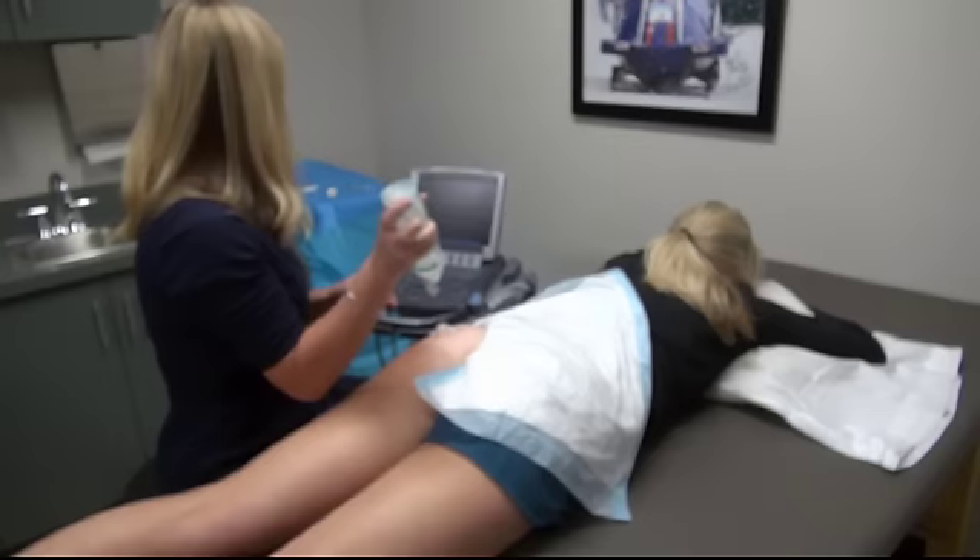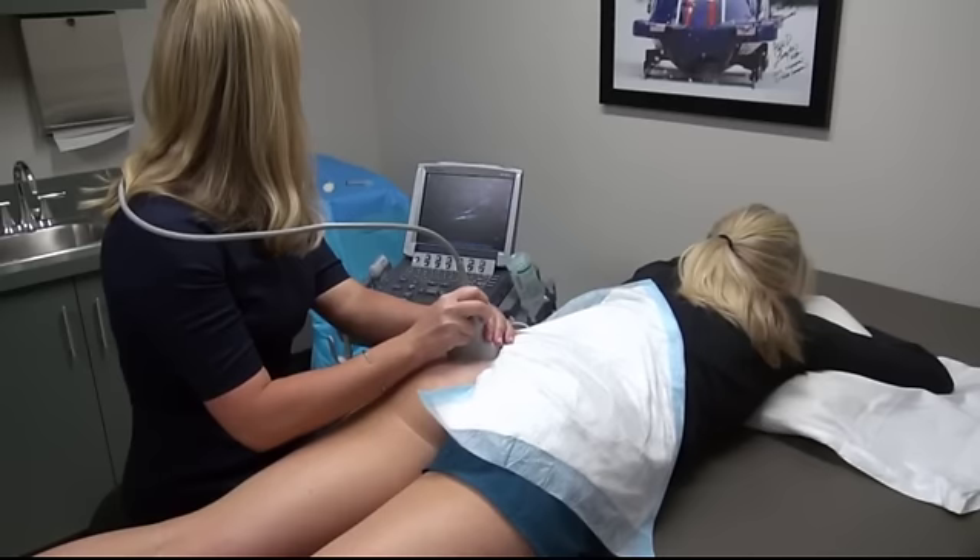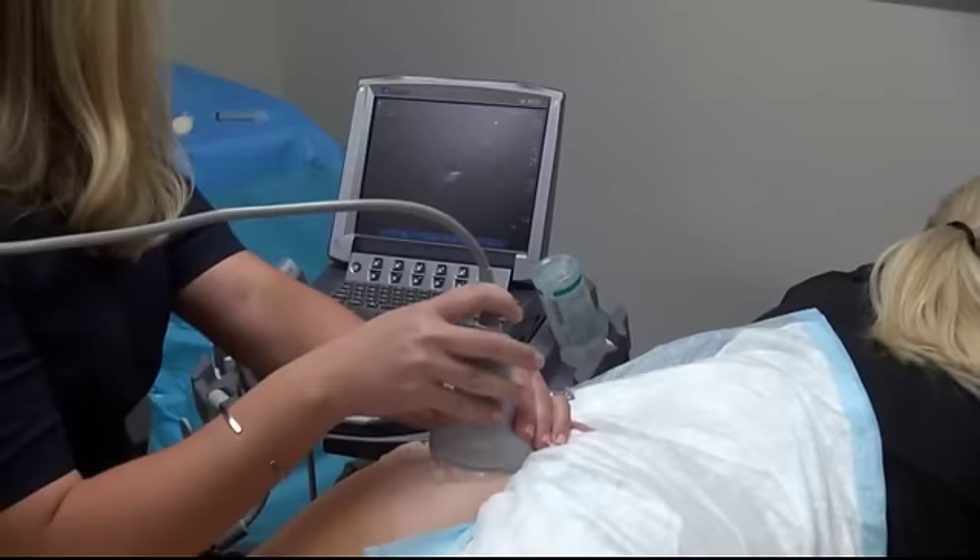Our center uses a Sonocyte mTurbo ultrasound system. Prior to the injection, a survey scan of the posterior hip anatomy is performed. Non-sterile gel is placed over the mid-buttock area and a curvilinear transducer is used to perform a survey scan of the piriformis.